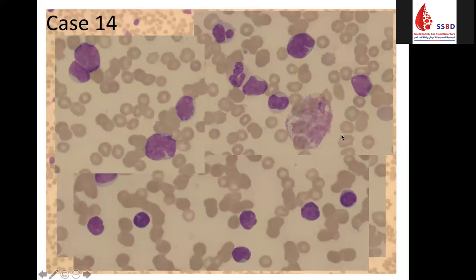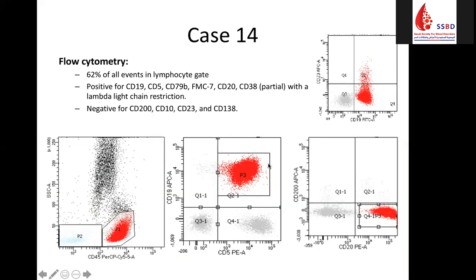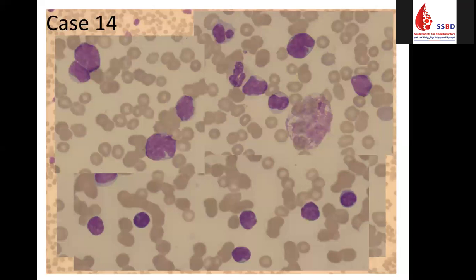Yes. This is suggestive of mantle cell lymphoma, the morphology. In mantle cell, we have different types. We have the blastoid, the small cell variant, and we have the pleomorphic mantle cell morphology.